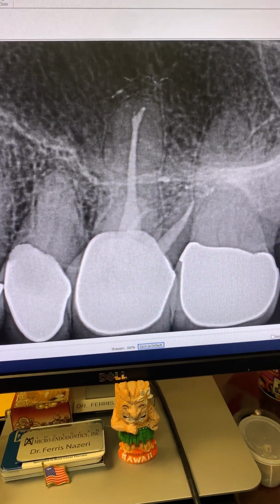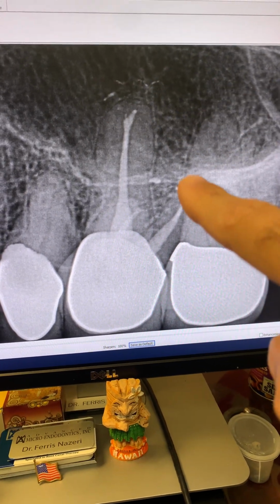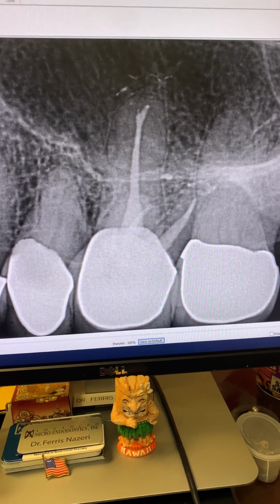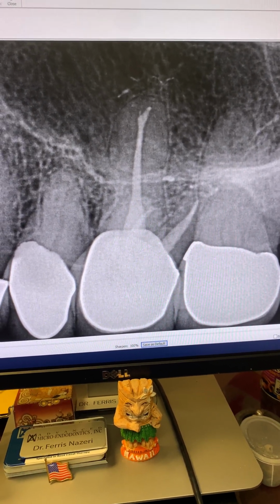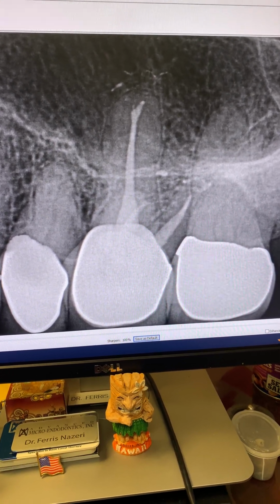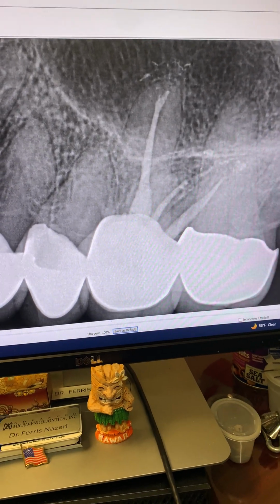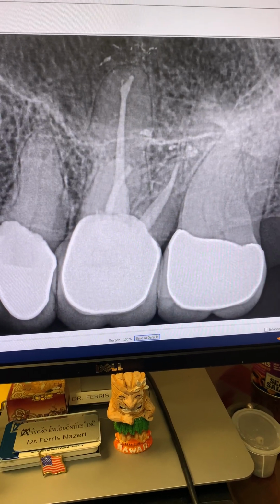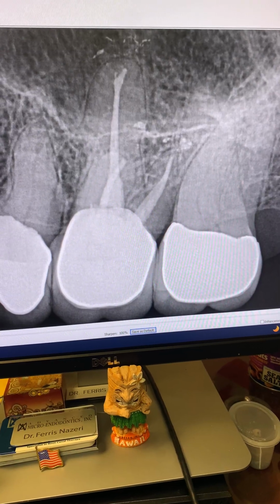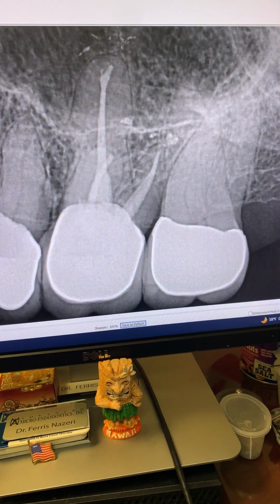We redid the root canal in one appointment, went through the crown, with some sealer extrusion here and here. Couldn't instrument MB2 because of calcification. Relied heavily on my sonic and ultrasonic activation of 6% sodium hypochlorite. And here it is, 11 years post-op of tooth number 14. As you can see, one appointment endo retreatment works as well as, maybe even better than, multiple appointments. Sealer extrusion has no effect on the outcome of endodontics, as you can see.